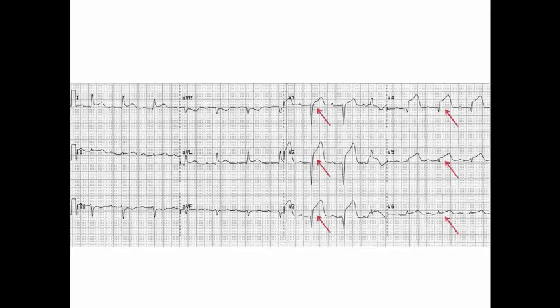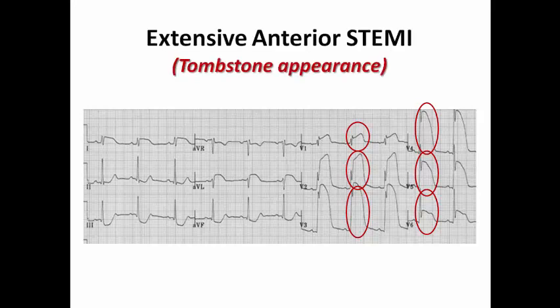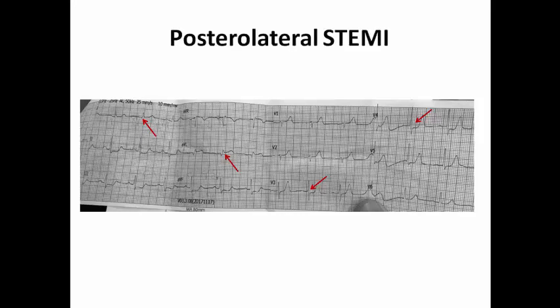In this ECG, ST elevation is present across the whole precordial leads and in aVL — extensive anterior STEMI. In another ECG, there is broad and marked ST elevation where the ST segment magnitude surpasses the amplitude of the R wave — this is the tombstone appearance, indicating extensive anterior STEMI with very high risk of mortality. In another example, ST elevation in aVL with reciprocal depression in inferior leads, plus ST depression with dominant R wave in V3 and V4, is suggestive of posterior MI — this is posterolateral STEMI.